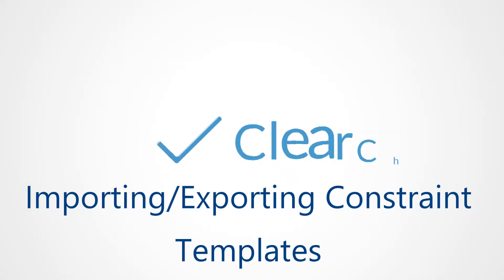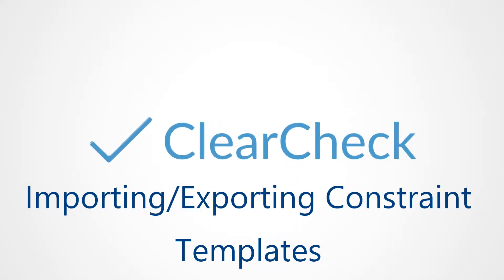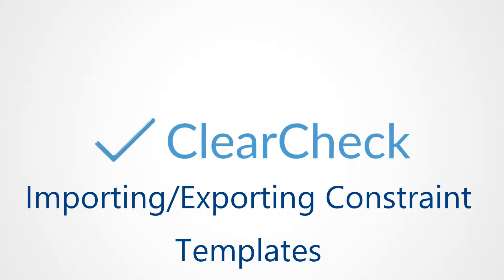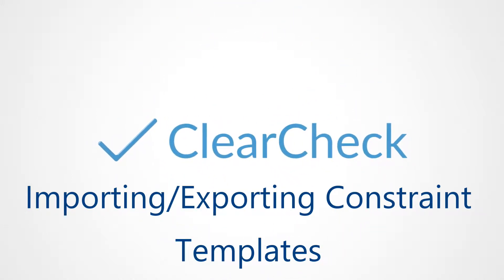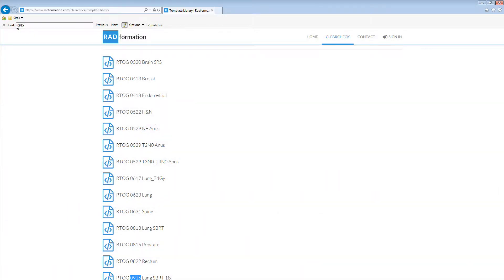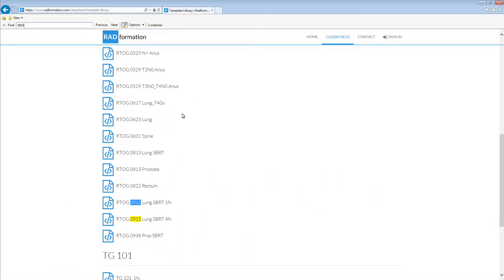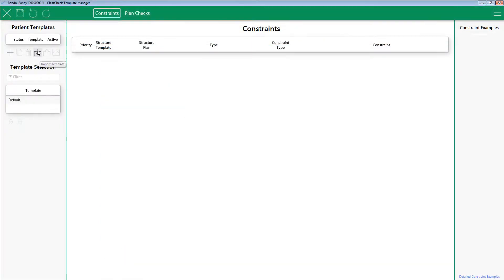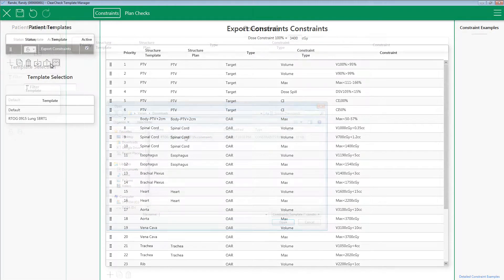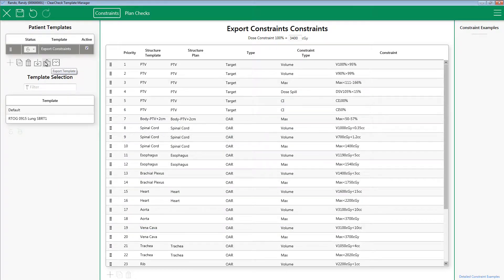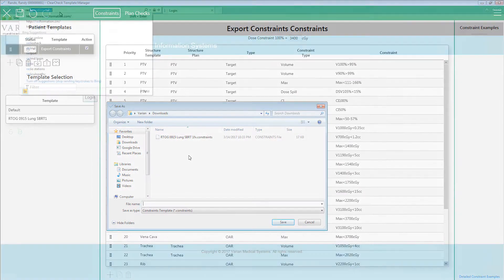Hello, and welcome to this how-to on importing and exporting constraint templates within the ClearCheck software. In this video, we will go through step-by-step how to download a constraint template from the Radformation website, then how to import this constraint template into ClearCheck, and finally how to export constraint templates from ClearCheck. Let's get started.